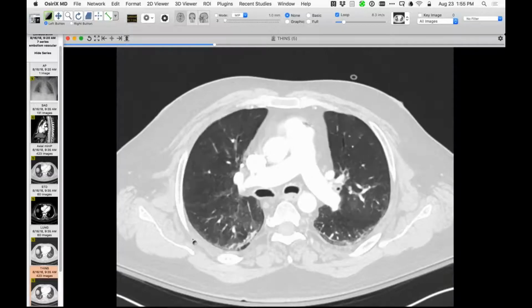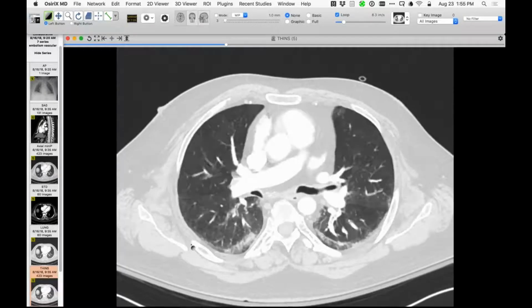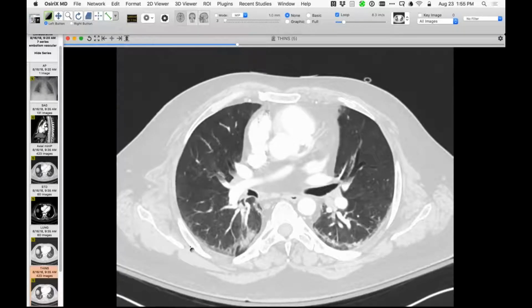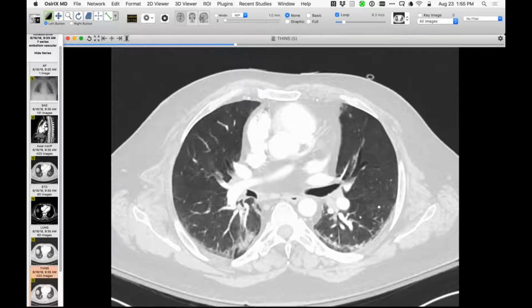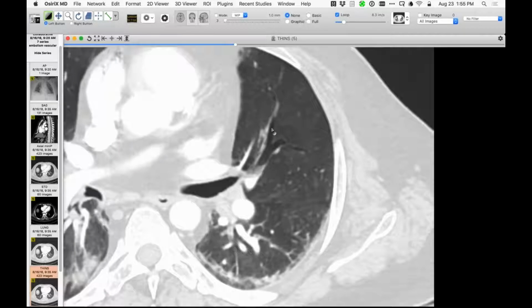Travis showed this before, and we talked about the notion of a double barrel sign of air embolism in pulmonary artery segments. Let me show you, this one is quite cute because I think we can see an airlock phenomenon. As you might imagine, if the air in the pulmonary artery impedes the flow of contrast medium, it's not surprising that we'll get a bit of contrast medium, almost like a fluid level, and some blood, and then the air producing a bit of an airlock phenomenon in that location.